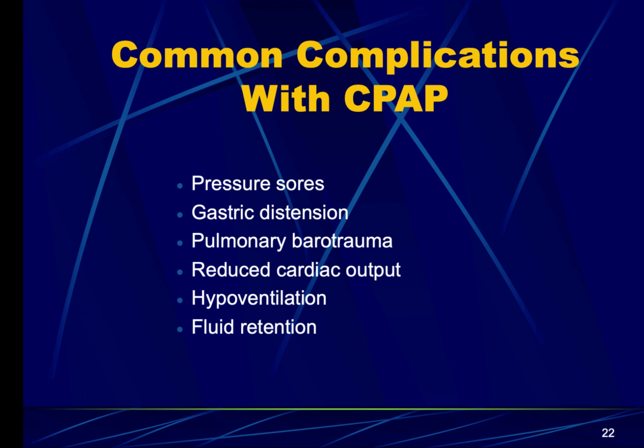Guys, don't be afraid of CPAP. I think it is, gosh, how do I want to put it, underutilized, I guess is the best way to put it, in EMS. I think there are a lot of applications where we could use PEEP or CPAP, but we choose not to. And I really think that with most of our people that have some sort of respiratory illness, PEEP can be very beneficial for them.